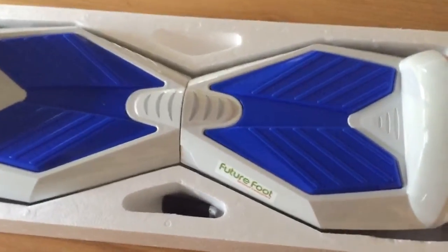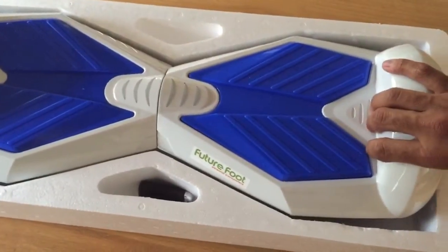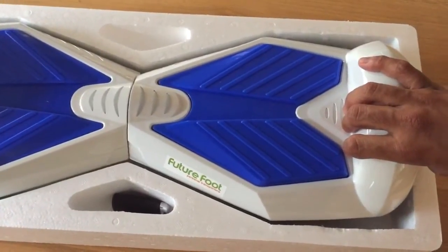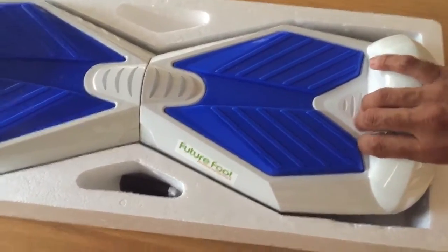Today I'm going to show you how to calibrate your future foot. All you do is fully charge it. Leave it charged for three hours. The light on the charger will turn from red to green, and that's how you know it's fully charged.